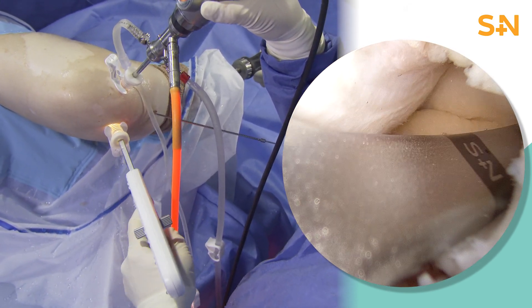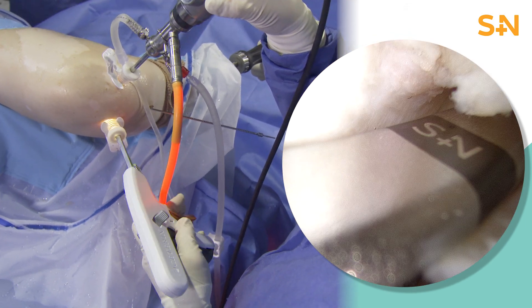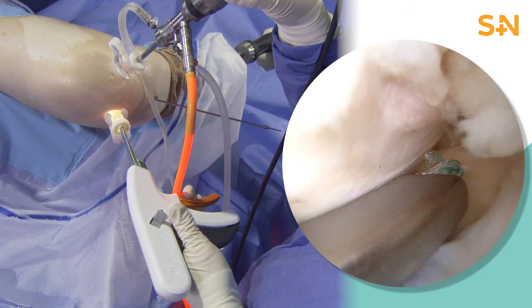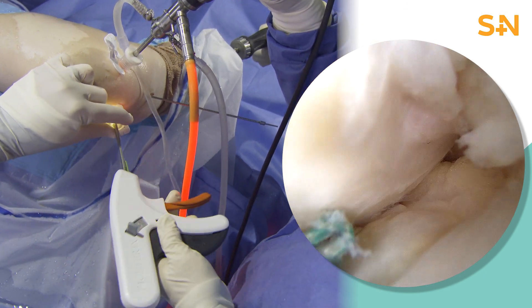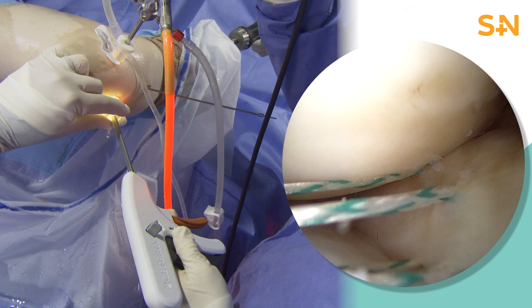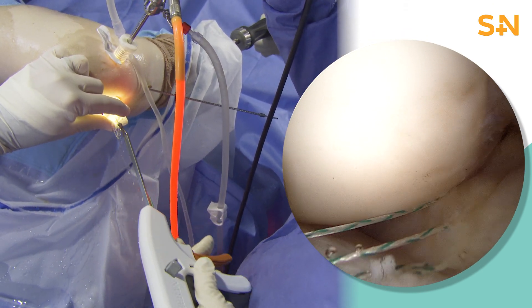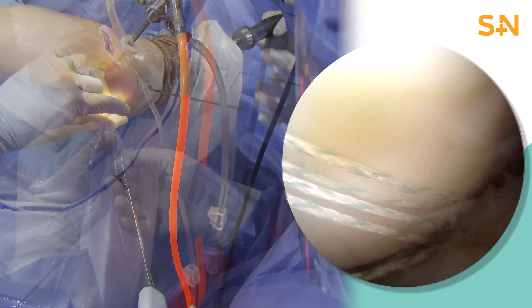In this case, we're using a NovoStitch Pro to do a modified double locking stitch through that posterior aspect of the lateral meniscus. This actually takes two passes through the meniscus, and instead of a standard luggage tag, it gives you two different points of fixation on that meniscus, improving the contact area and improving the overall fixation of that meniscus.